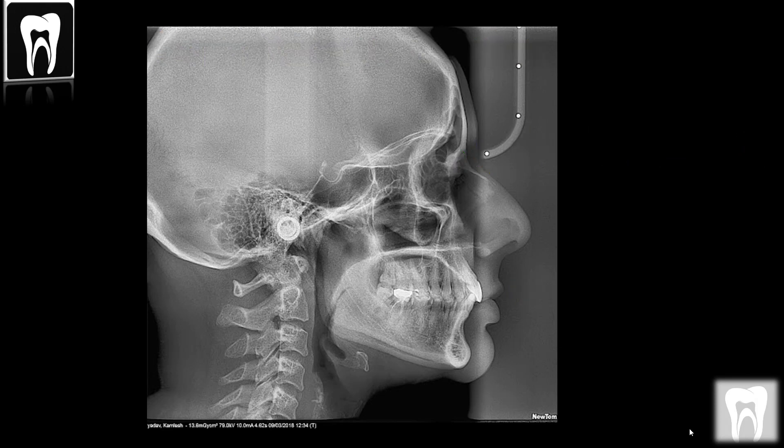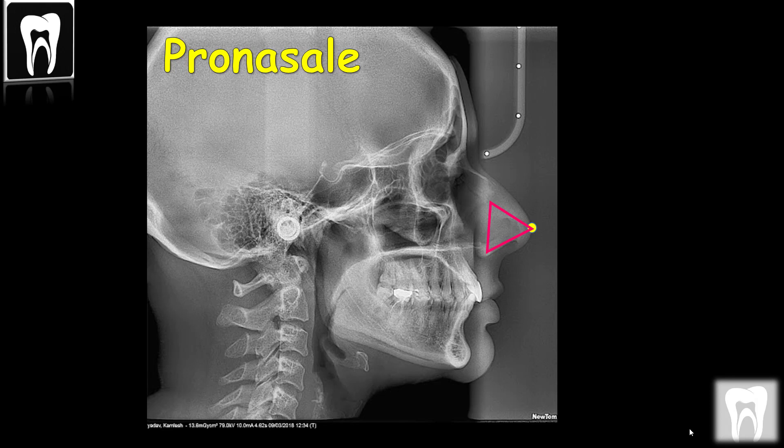Pronasal is the most anterior midpoint of the nasal tip. If a bifid nose is present, the more protruding tip is chosen to determine the pronasal.